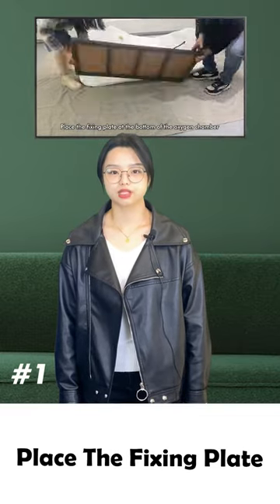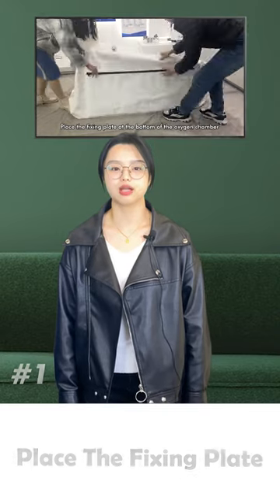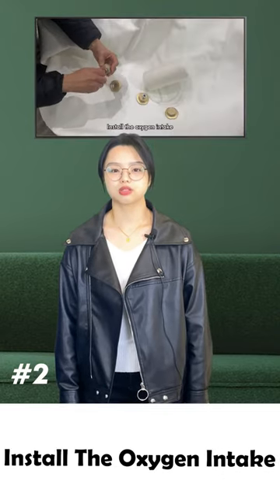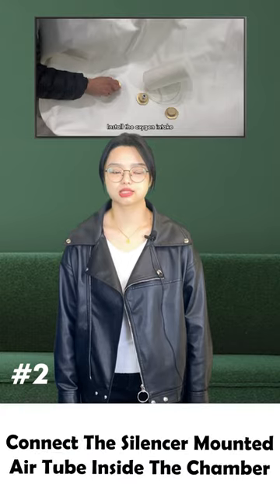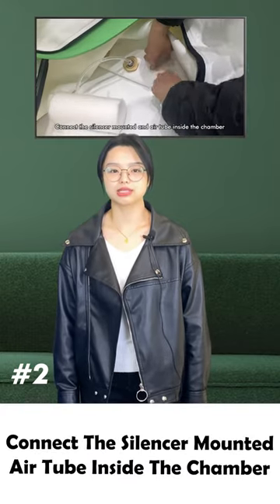Firstly, place the fixing plate at the bottom of the oxygen chamber. Secondly, install the oxygen intake and connect the silencer mount and the air tube inside the chamber.